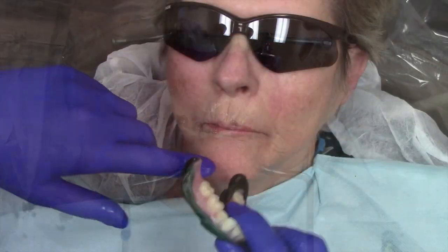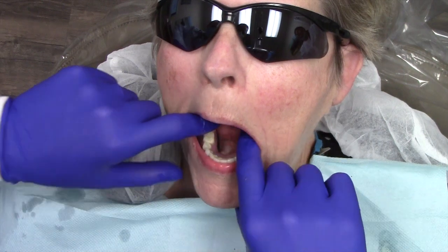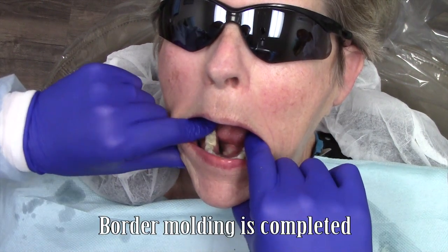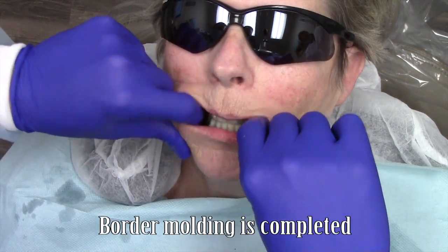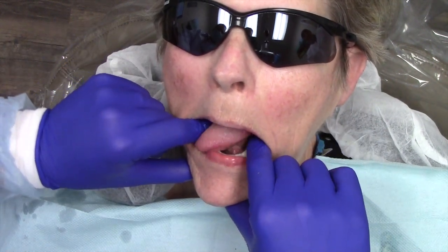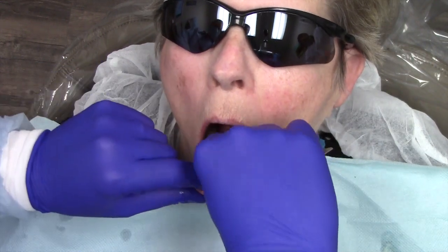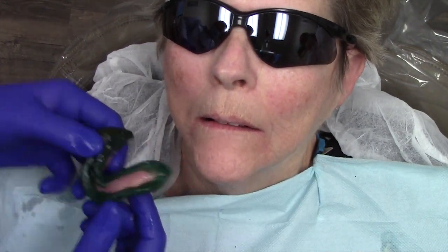Because a moderate amount of alveoplasty is often performed during implant surgical procedures, I like to do a laboratory reline of the denture after locator RTX abutments are placed. I find this results in greater control rather than a clinical hard reline. However, if you prefer to perform a chairside hard reline, you may do so.